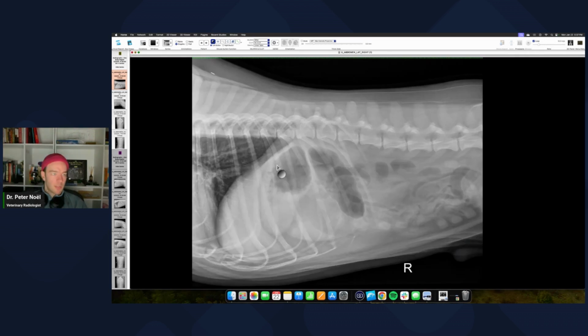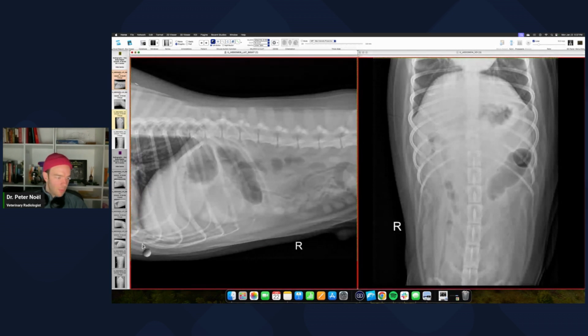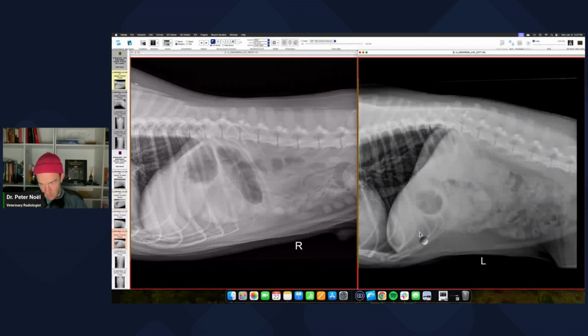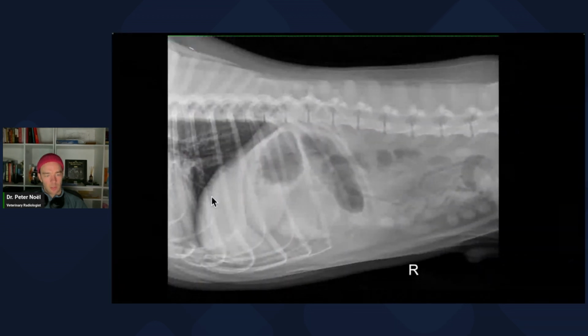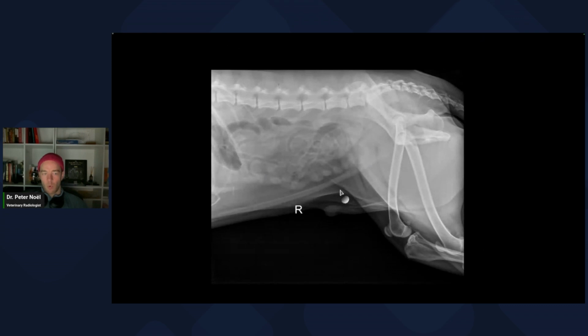And when you put these up side by side, what you'll notice is that the shape of this one, on the left, you've got the recent ones, and on the right, boy, there's not a lot of fluid in either. Maybe there's a little bit of fluid in there. That's not super black, super radiolucent. I don't think there's any fluid in here. I think that thing is squeaky clean. There's rugal folds right here. And then none of the small intestine is more distended.